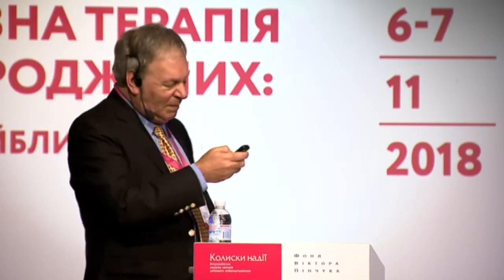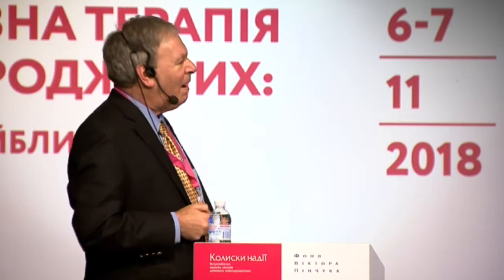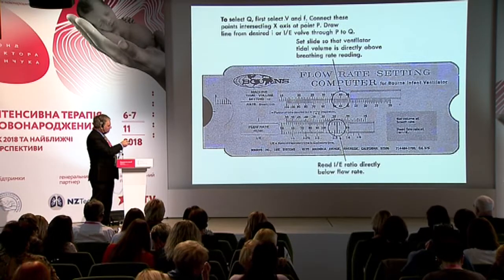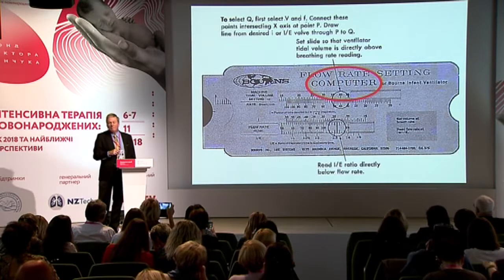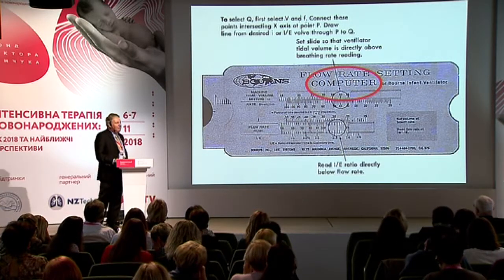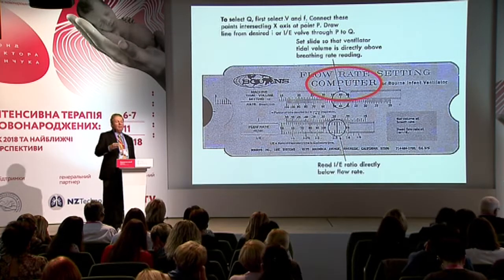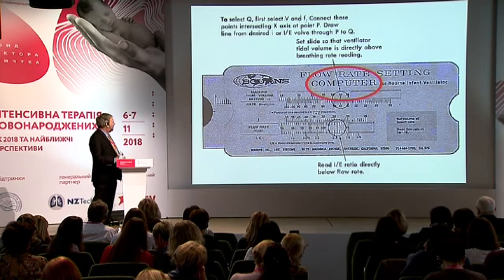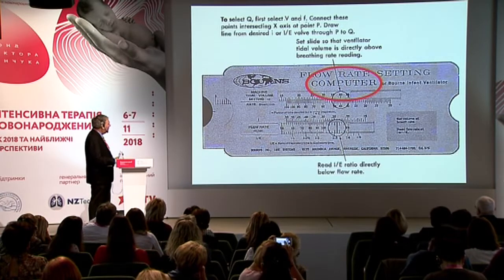But one of the really big problems we had was the difficulty in measuring the small tidal volumes that these babies required. Well, the company was aware of this, so they provided us with a bedside computer to help determine the volume of gas. There. It says computer. Well, with all kidding aside, this was how we tried to calculate the compressible volume loss and try to subtract that from the actual delivered tidal volume to figure out the volumes that we were giving these babies. And I can tell you that it wasn't very accurate, and we probably did a lot of harm.